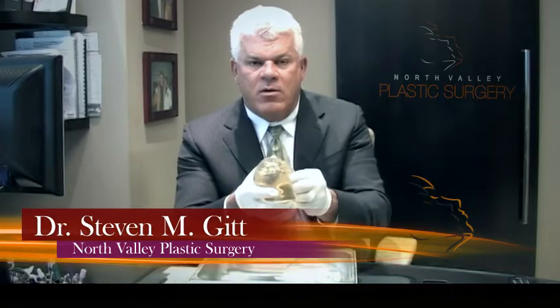Now, this generation 2 breast implant, like the one I'm holding in my hand, had a much more liquid type of silicone gel than do the present implants, which really have silicone gel with a consistency almost like a gummy bear, the so-called cohesive gels. These older style implants felt very nice. They're nice and soft and squishy to the touch, and they feel very much like a natural breast. The problem is, if and when one of these old style implants would rupture, the silicone gel would permeate throughout the breast because it was more liquid and could sometimes even travel to other parts of the body.